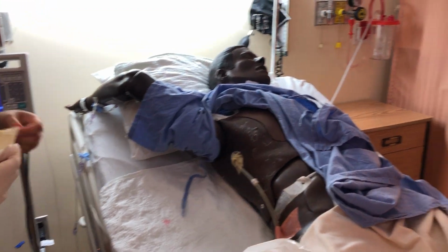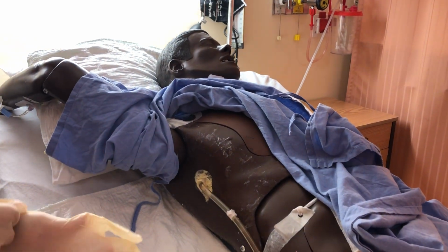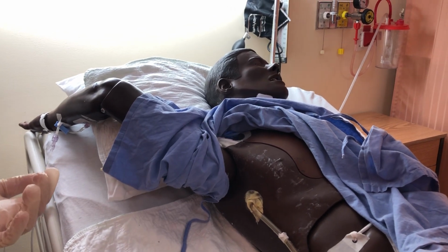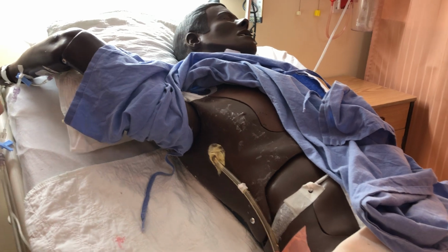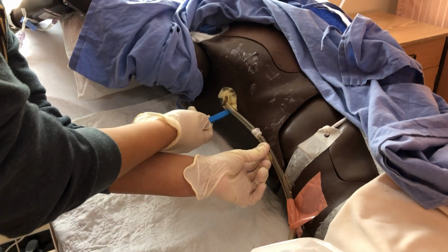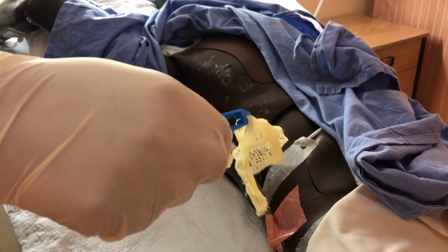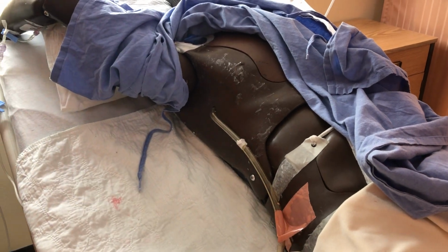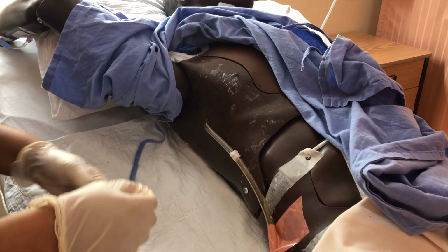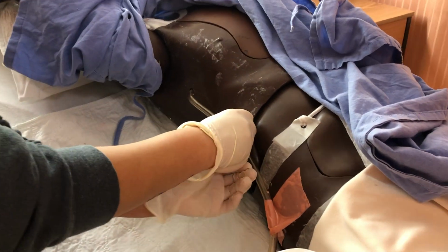For me, I would add that to my field. Drying now. And also just making sure I don't contaminate my field. Okay, and then removing the dressing here. Okay, so I'm gonna use my blue forceps to remove my. Okay, and I'm going to discard that. Alright, just to note, I'm gonna first assess this site. There's no signs of infection or purulent drainage. I do realize there's a bit of dressing left, so I'm going to attempt to remove that.